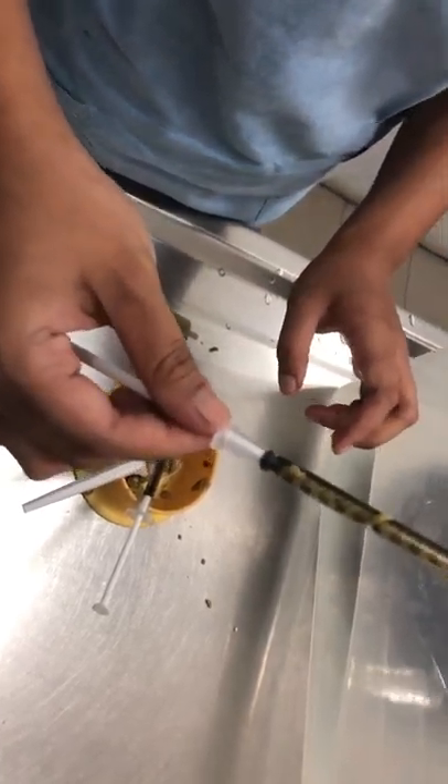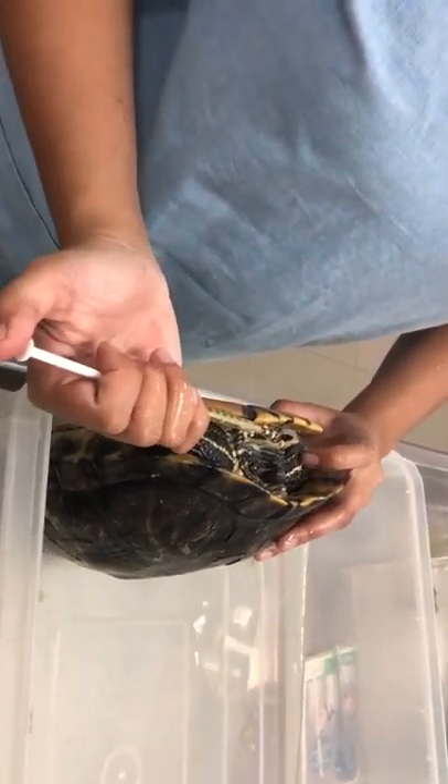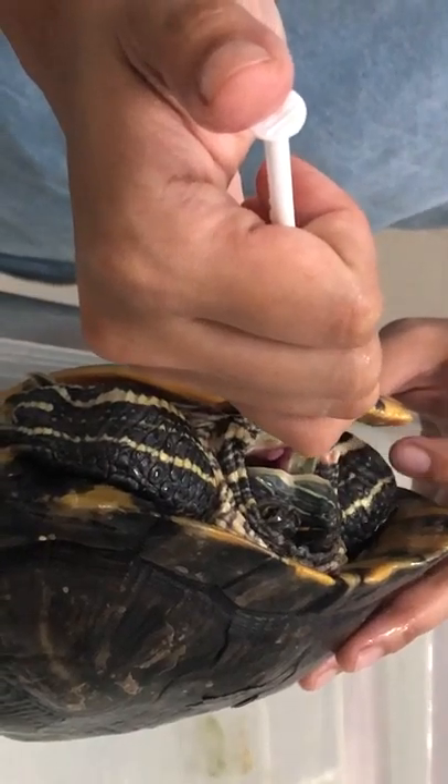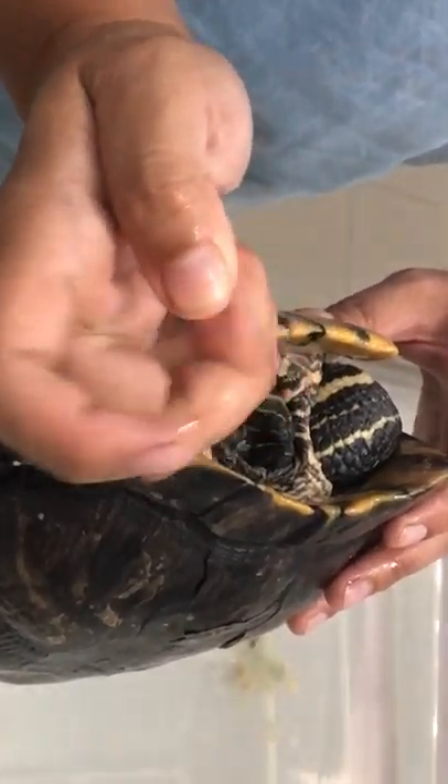Now this is ready for the feeding. You need to hold the terrapin like this. After that, you can take care of the size of the hand or size of the mouth so that he can open the mouth. At that time, you need to push the syringe into the mouth and then shoot slowly.